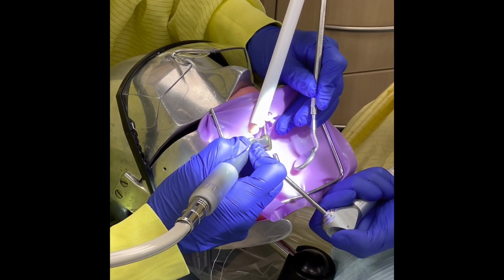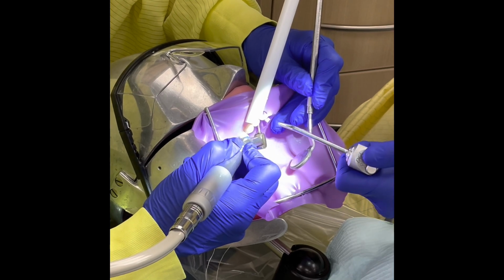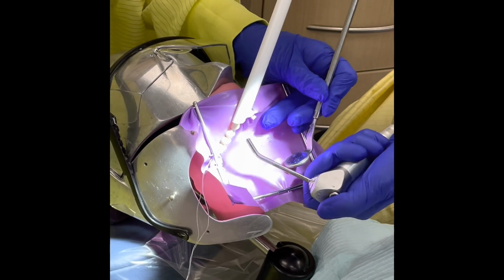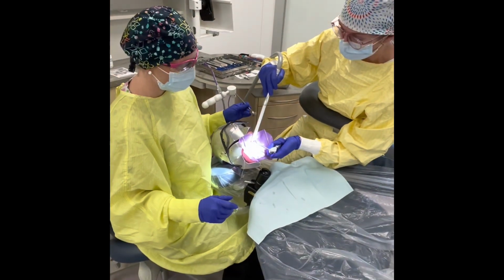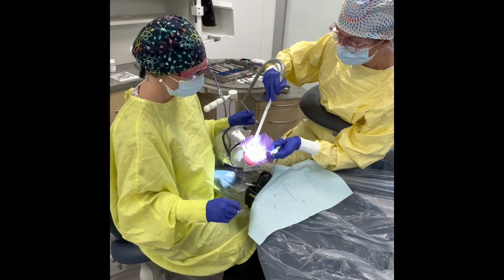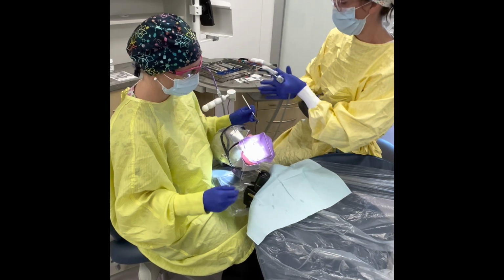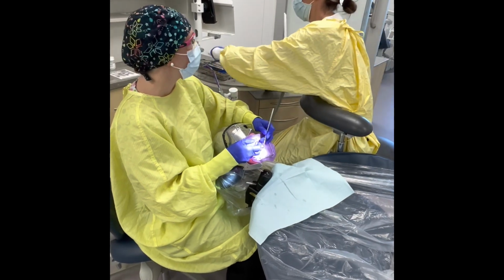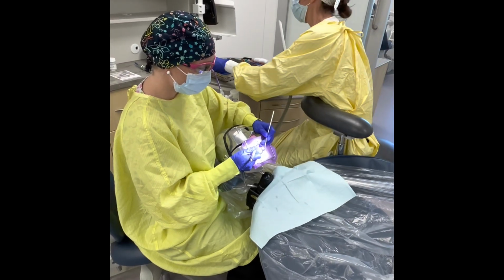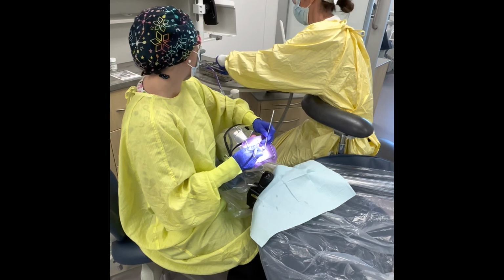Okay, that's what Stacy's doing. Again, careful not to block the mirror. Okay, and we will rinse and dry again as we have taken the hand pieces out. Okay, and I'll take my explorer again, please. Thank you, Stacy. Okay, so that preparation has been completed.